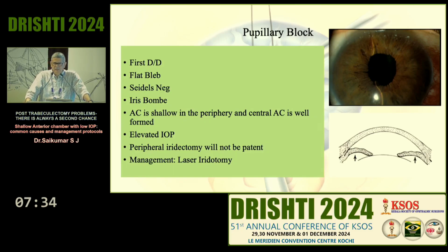Normally, when we do a surgical PI, we usually check whether it is patent on the table itself with the flow of aqueous at the end of surgery. But if it is not patent, it is one of the causes. Of course, you can have an air bubble which can cause a temporary pupillary block. For a very shallow chamber, if you have put in some viscoelastic, that can cause it. If it is a complicated surgery or a surgery combined with cataract and you have some vitreous in the anterior chamber, that can cause a block. So whatever is the cause, the treatment to relieve the pupillary block is a laser iridotomy.